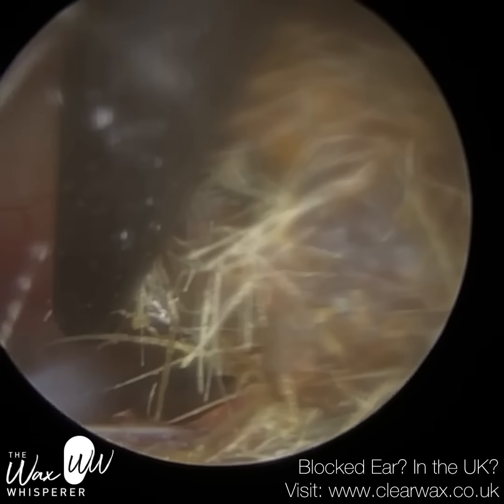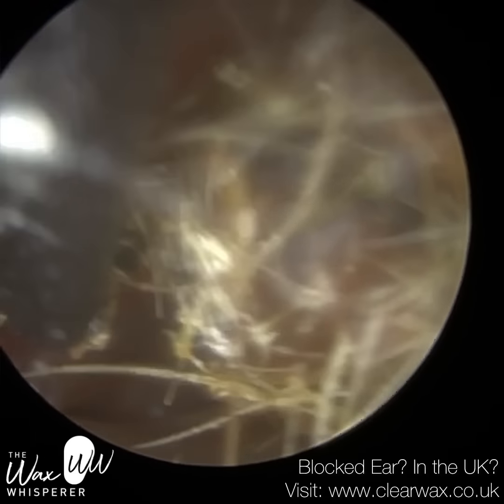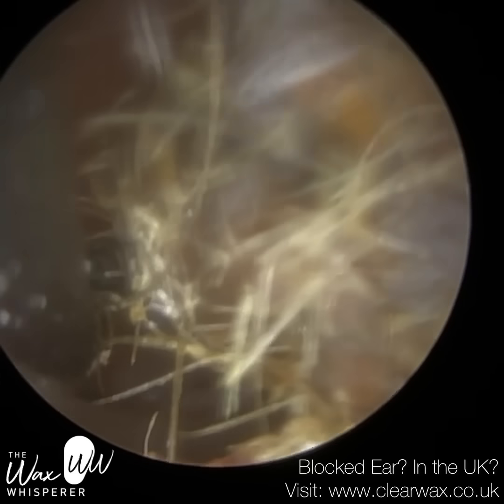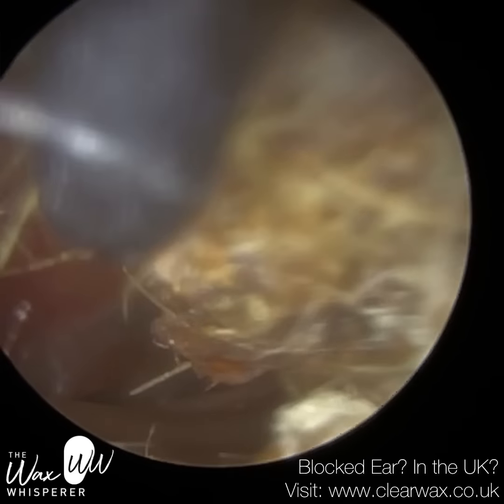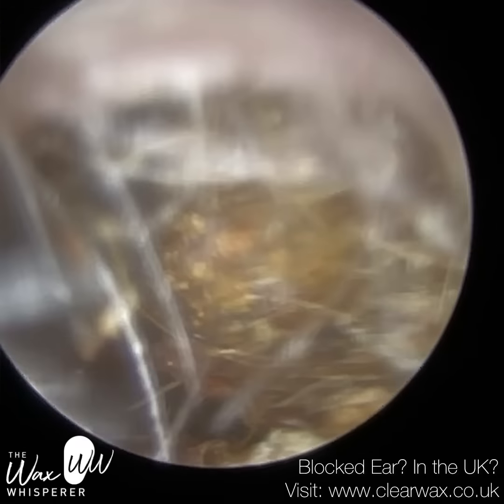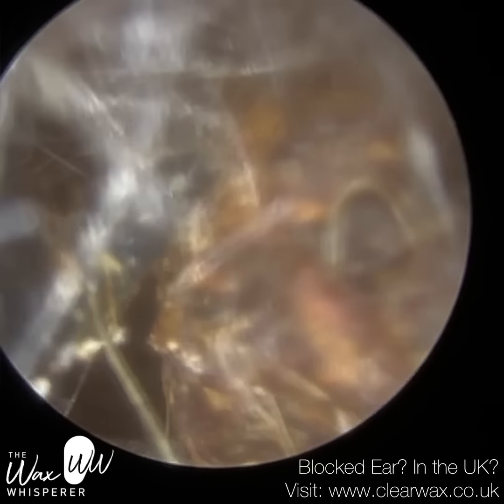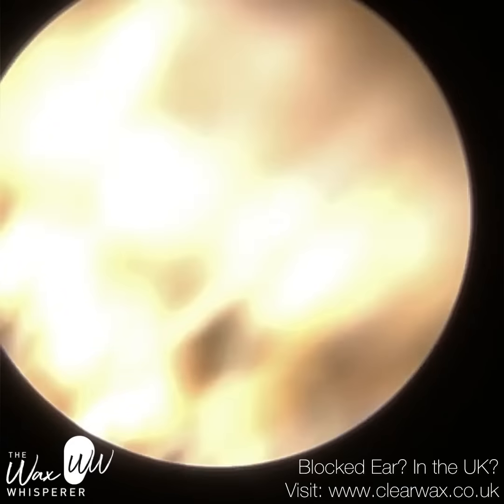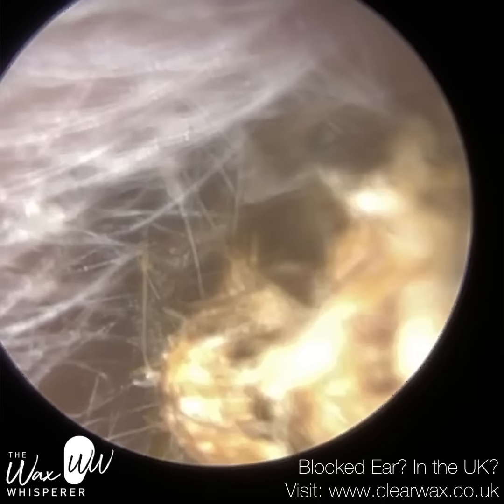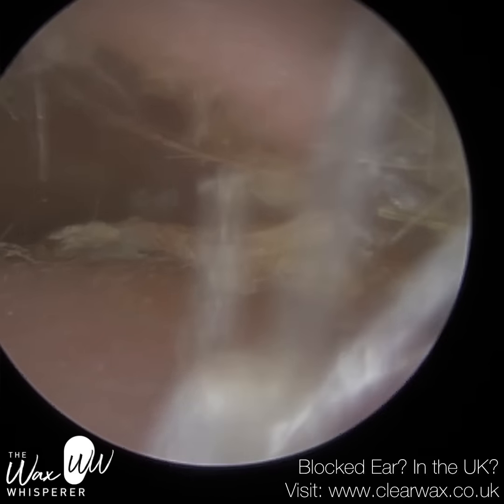This was an extremely hardened ball of keratin, and so I've got the tip of the ear hook locked in behind, and I'm just going to roll this. You've got to be careful when pulling the hook and extracting it that you don't lose control, because if this hook goes over the keratin ball, for example, or through it, you put so much force behind it, you've got a flailing instrument in the ear, and that tip can actually quite easily cut against the side of the ear canal. So you have to do it in a controlled manner.